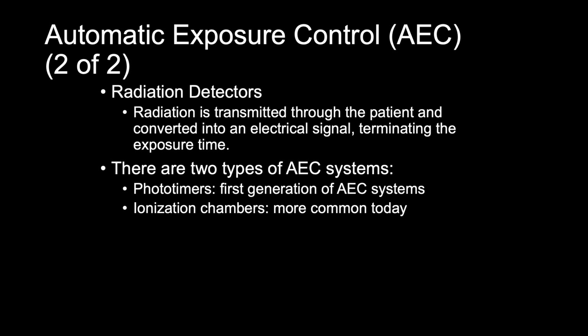So if you are using the detector for, let's say, a chest x-ray, you will pick the top 2. There are 3, and on the next slide you'll see those. But there are 3 on every bucky. And you'll pick the top 2, which is left and right, for a chest x-ray. If you're doing an abdomen, you'll just pick the center one.